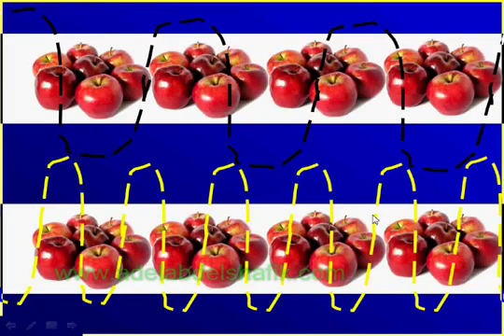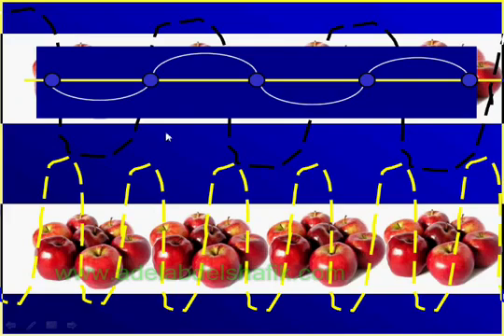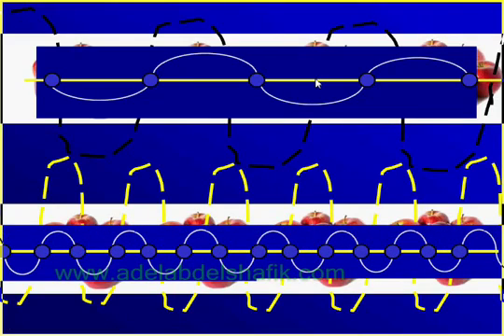So I'm going to send back to the instrument that I get all these apples. In this case, I send back information only about these 5 apples, but on the bottom row, I'm sending back so much information for every individual apple. What does it mean? It means that when the frequency is high, I'm sending back to the instrument more and more information. So this will give me a higher resolution, better information of things coming back to me.